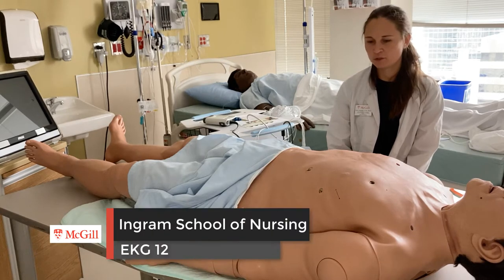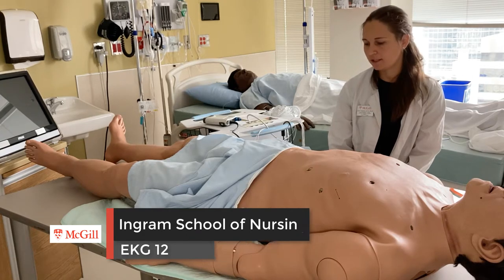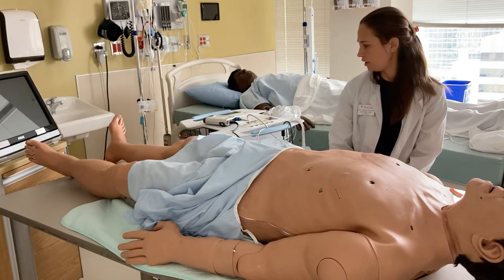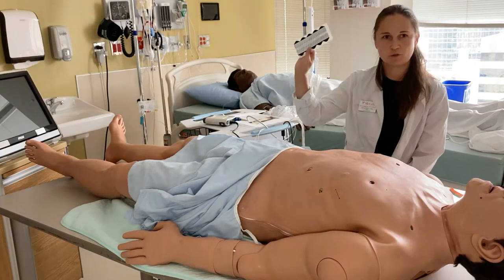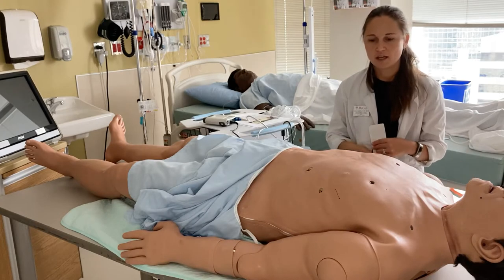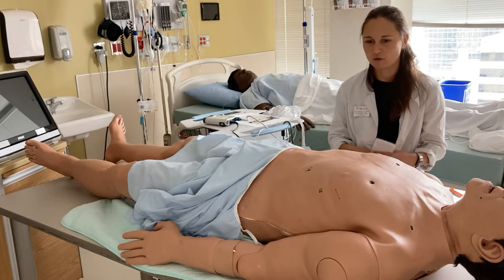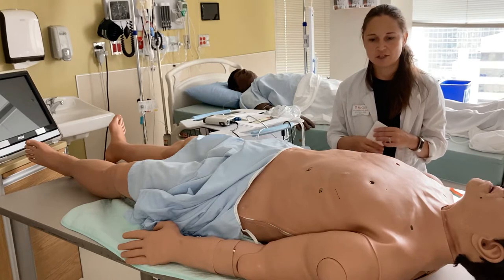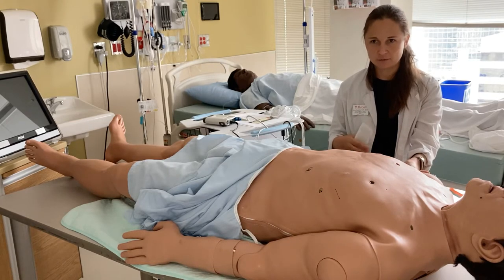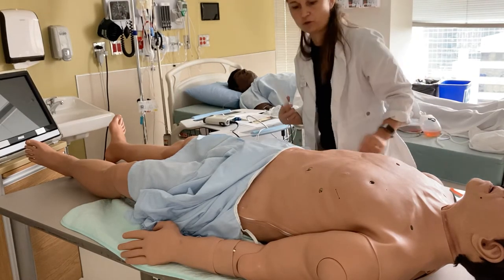Hi everyone, in this video we will show you how to place leads for a 12-lead electrocardiogram or EKG. All you need is your EKG machine, your stickers for electrodes, and your patient — who you have already double-identified, gotten consent from, and ensured has privacy. The patient is currently lying flat, which is the best position for an EKG; however, if you need to raise their head a little bit, that is okay.